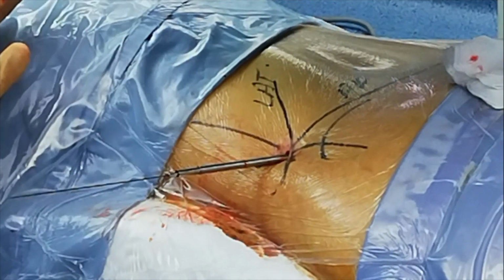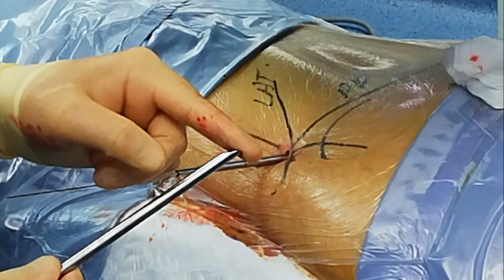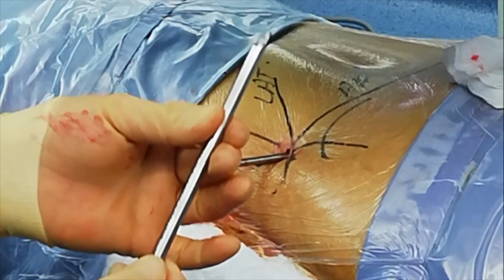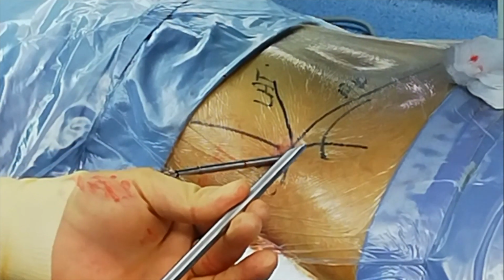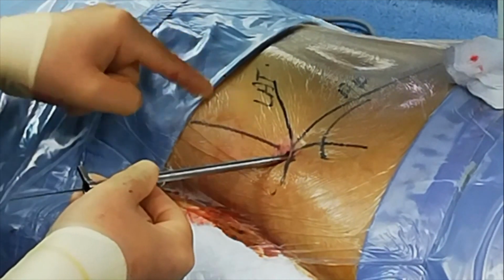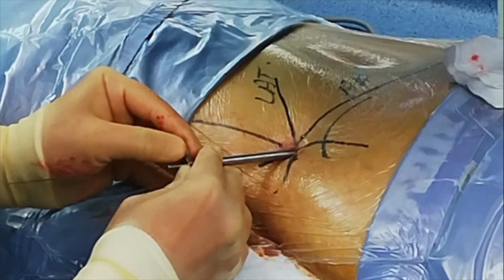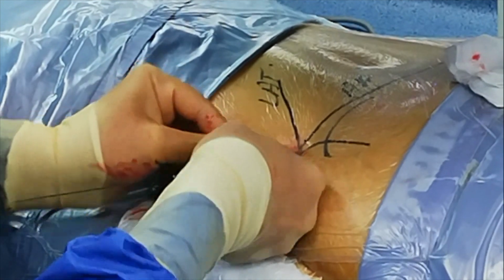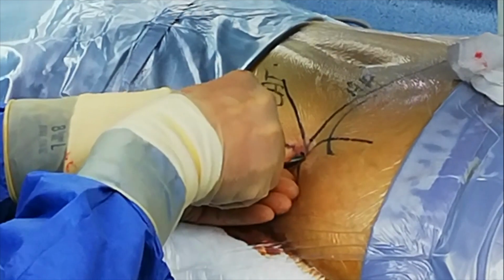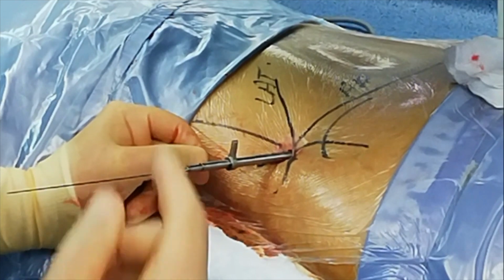And this is the head of the patient. This is the feet side. So we need to stay away with the sharp end of the bevel from the exiting nerve root. So this is how we go in with the working cannula. So away from the nerve root, so the nerve root will come in that position, as you know. So the sharp end is caudal. That's it. And once I position that, I direct it up dorsally so that we will be looking towards the facet when we put the scope in now.